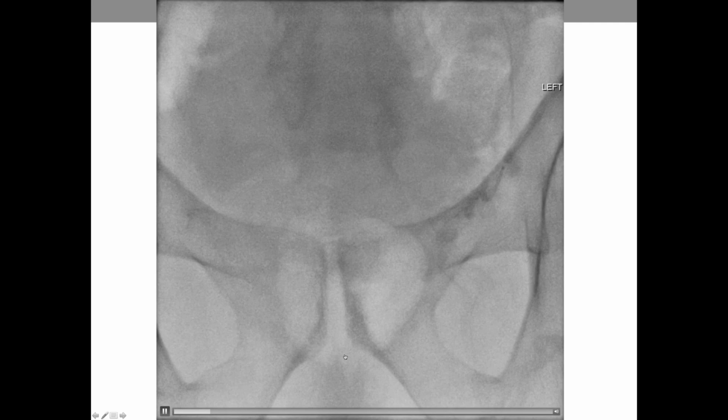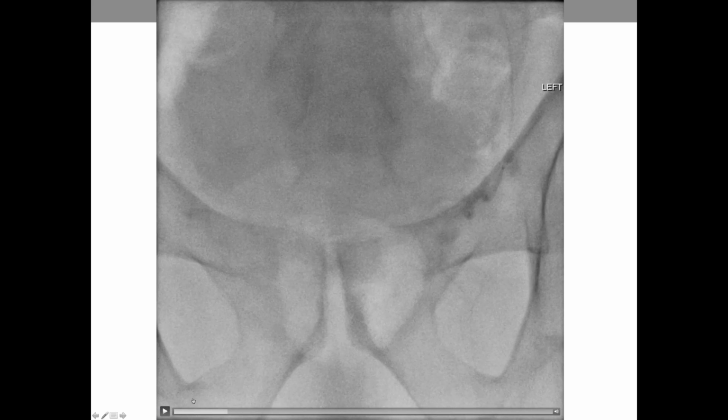We embolize, and people often ask me, well, how do you know what your endpoint is when you're embolizing with a balloon occlusion microcatheter? And the key is that it's not all that different than embolizing with a conventional end hole, because you still have flow. It's still free flow embolization, but the flow is coming from somewhere else. It's not coming from behind your catheter like it usually is. It's now coming from below. And so what you do is you inject a small aliquot and you watch.